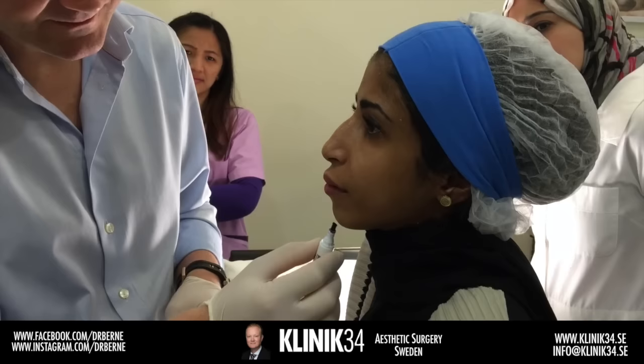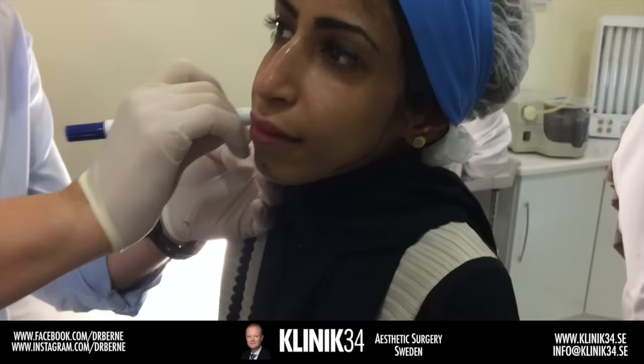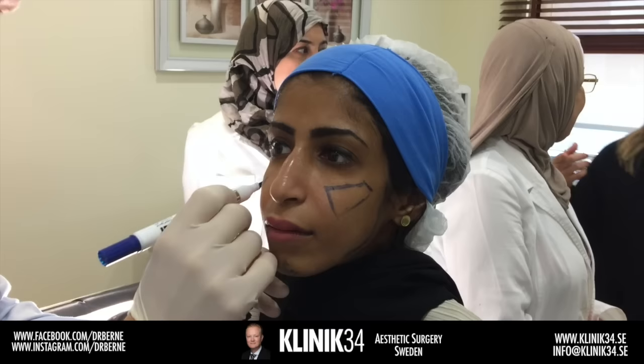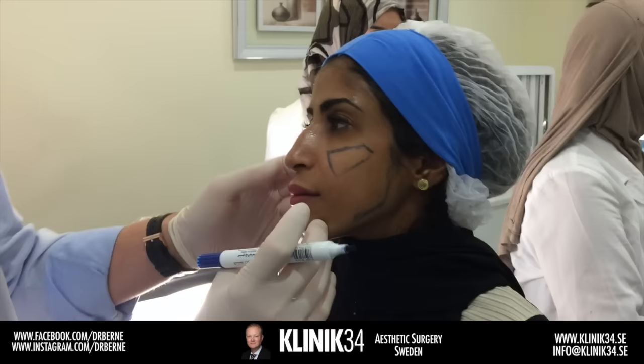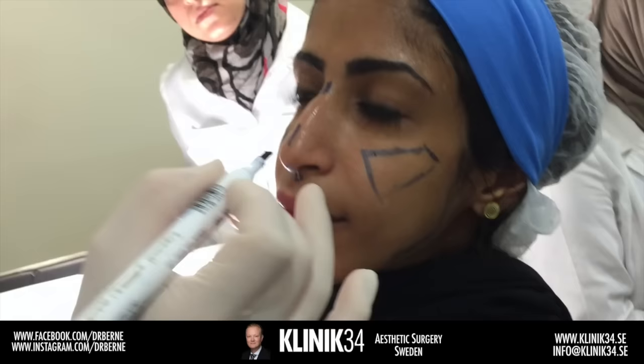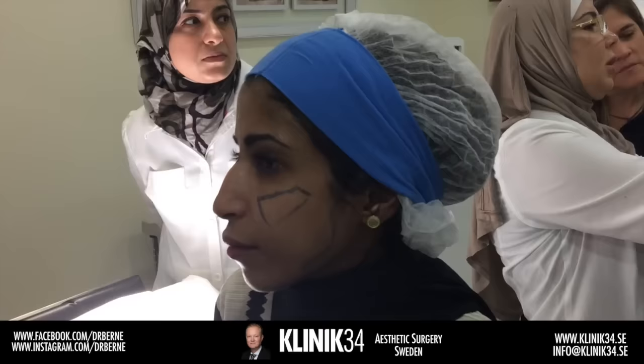To create better balance we need to add volume in the chin area. We're going to widen and define the jawline, reduce the thinness of the face by adding volume in the mid face, and finally to create better balance for the nose we're going to add volume here and here. So to frame the face: mid face, jawline, chin, and nose.